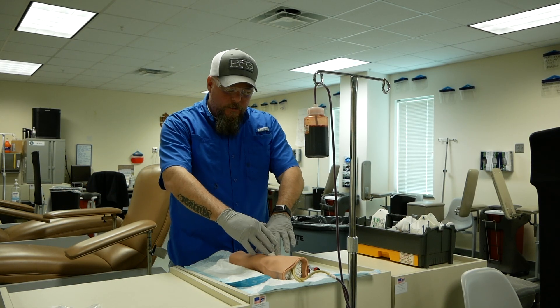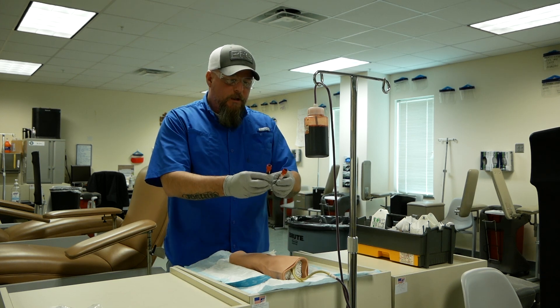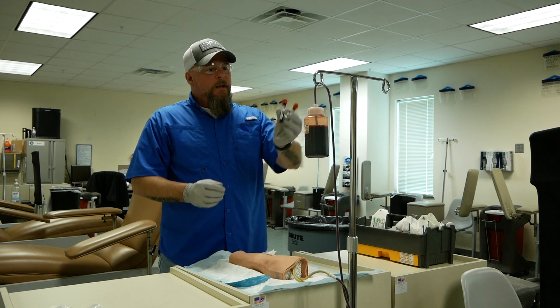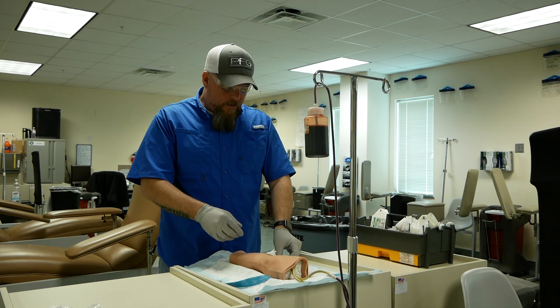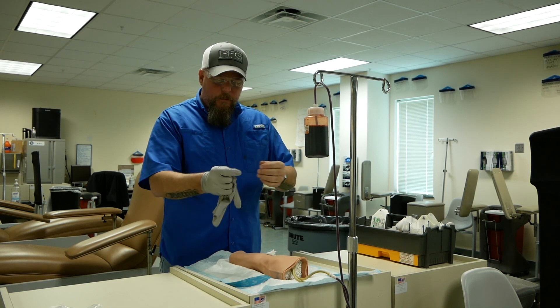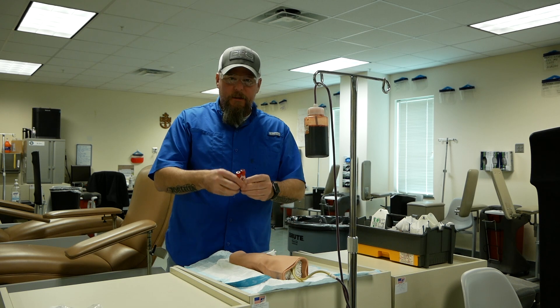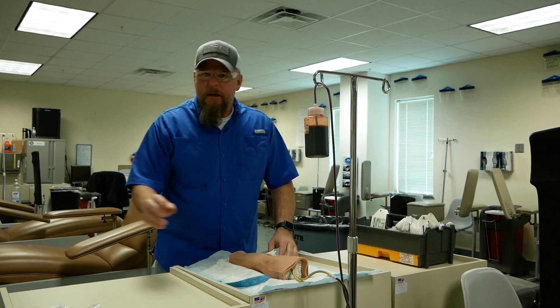This is where we would verbalize that we would tape the gauze to our patient, and we're going to pick up our blood tubes. Inspect to see if they have any additives and if they do, gently invert them. After that, label your tubes with your patient's information. Set these down, discard any bloody materials, doff your BSI, perform hand hygiene, and document. Once you document, verbalize that you would take your specimens to the lab. And that is venipuncture.